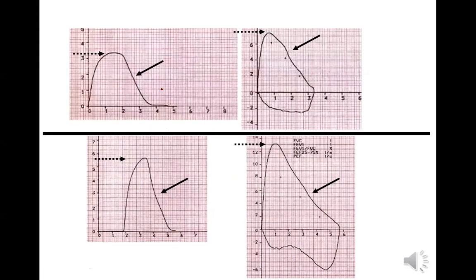So this is a better depiction. Now, this is a good one. This one, the student, this is FVC. And this is FVC, the one we saw before. The one on the right is not FVC. These two, patient 1 and patient 2, they're two different people. These belong to the same person. But these two are different people. Like this is patient 1, this is patient 2. Two different people, got it? And demographics are completely different. So the predicted values are going to be different.